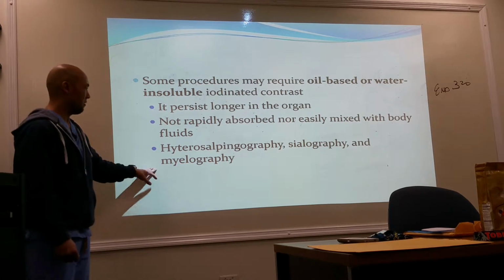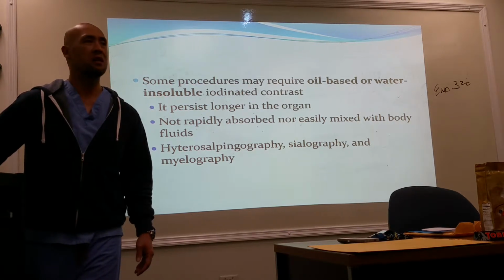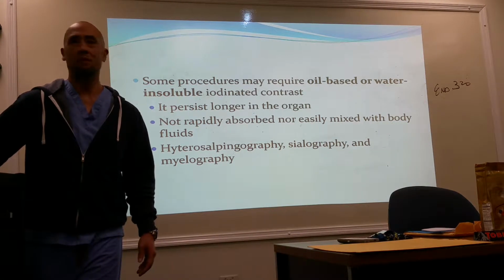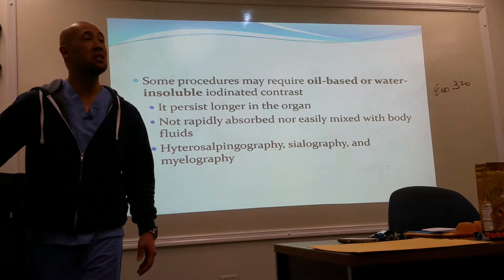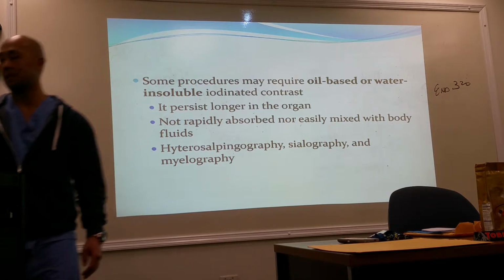And then here we have myelography. Okay, you guys know what myelography is, right? It's a study of the spine? No. Bone marrow? Nope. It's a study of the sheath of the spinal cord. Spinal cord. Yeah. The myelin sheath.